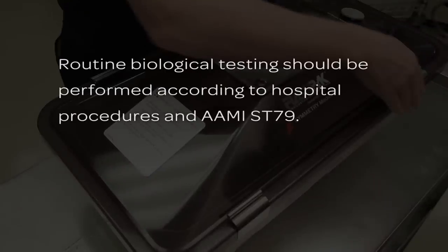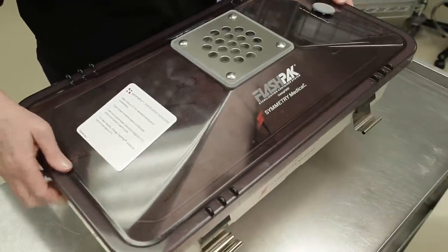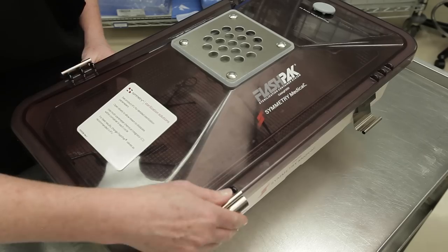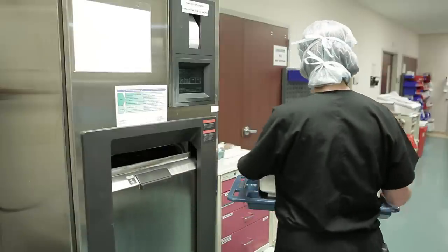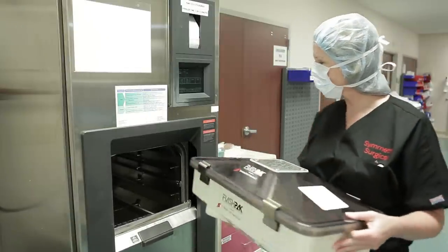Routine biological testing should be performed according to hospital procedures and AAMI Standard ST79. Additional chemical integrators may be added as required by hospital procedures and recommended practices. Place the lid on top of the base and secure the four latches, ensuring that the lid fits snugly on all four corners before latching.